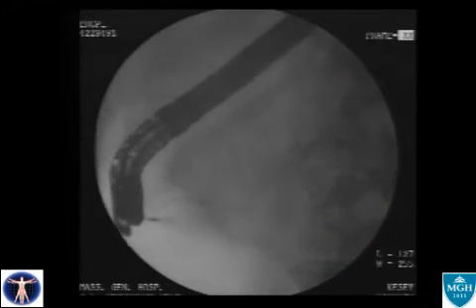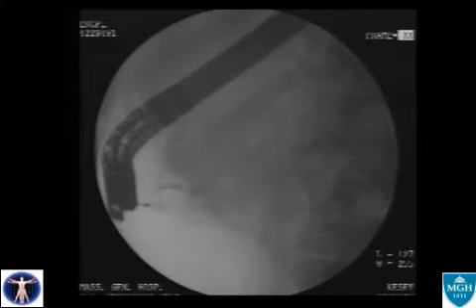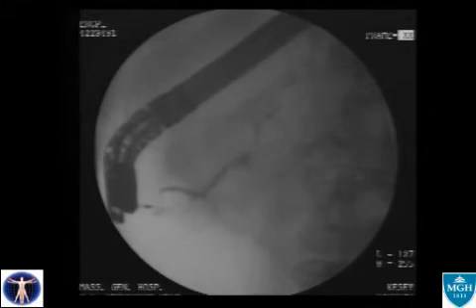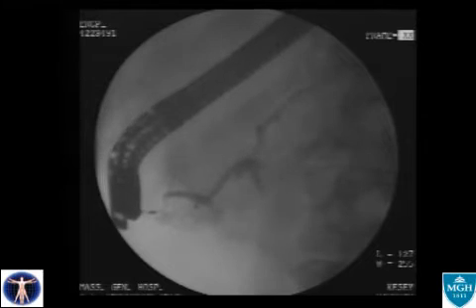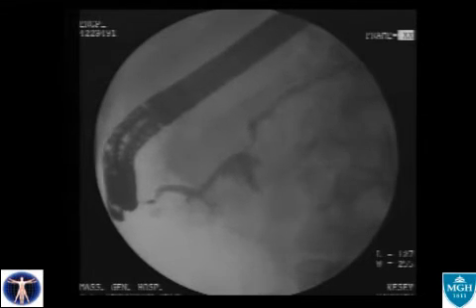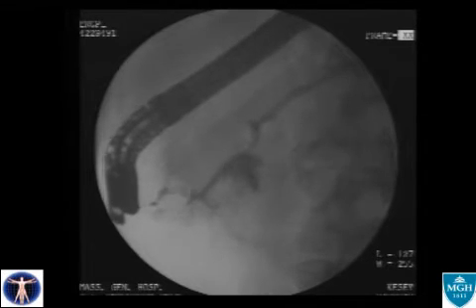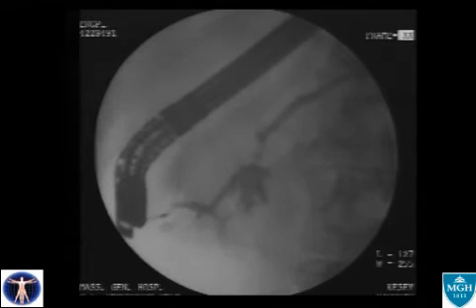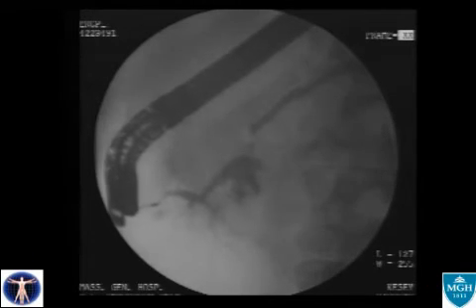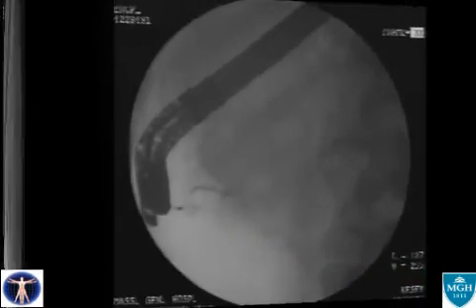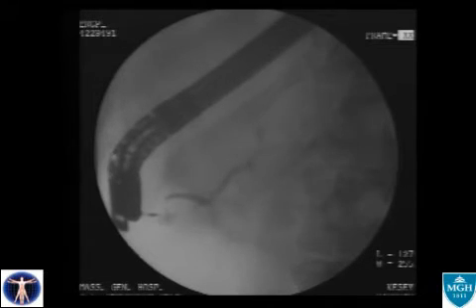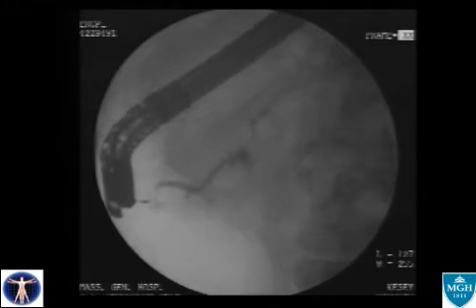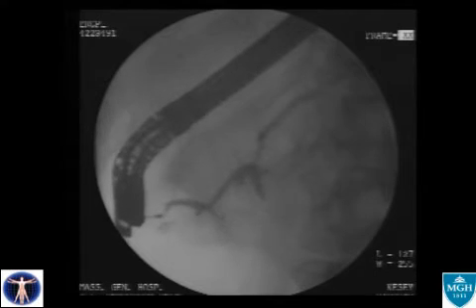Contrast fills this duct, revealing not only a pancreas divisum anatomy, but also this cystic structure — the pseudocyst seen on the CT images. A slow-motion review of the sequence clearly demonstrates the precise location of the pseudocyst.